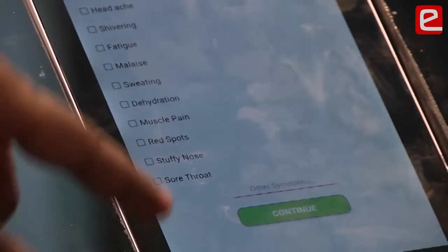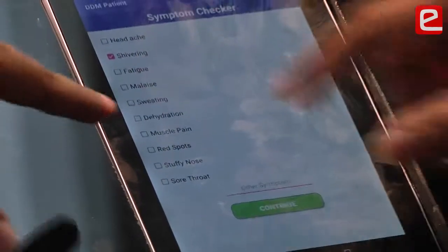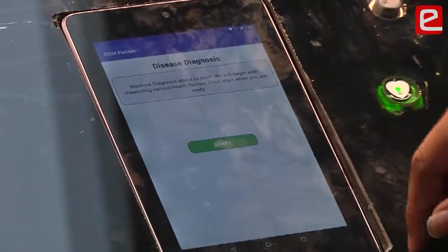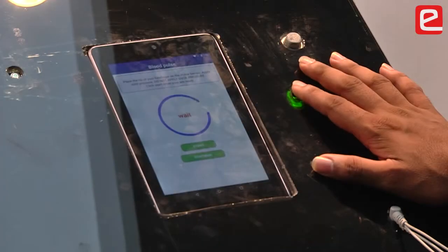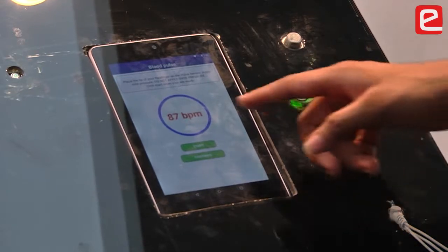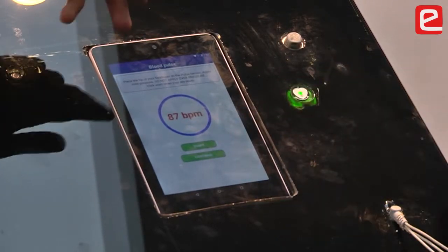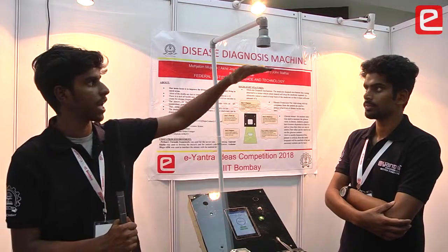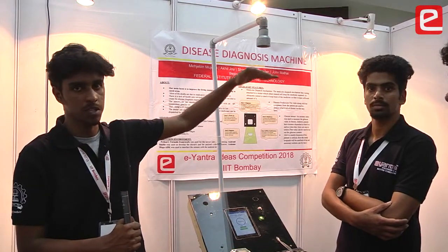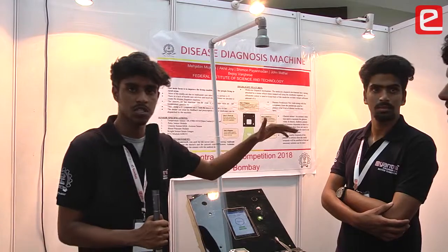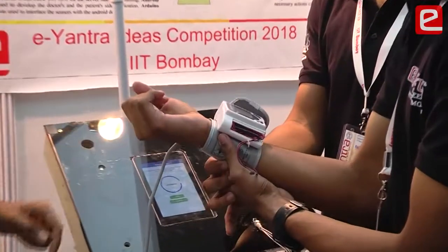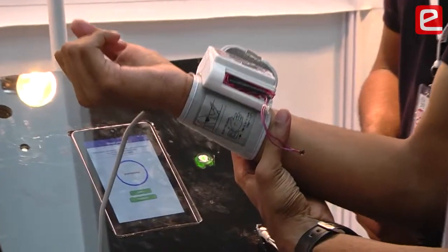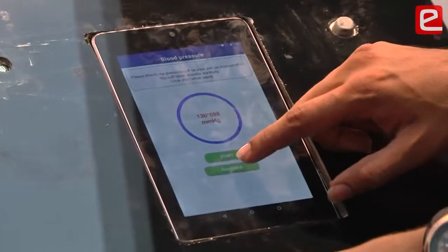We check mark the symptoms we are facing. If a symptom is not listed, you can enter it using the other symptoms option. Now let's check mark the symptoms and continue. The machine starts diagnosis — the pulse is measured at 87 BPM. We can also measure height using an ultrasonic sensor, which measures total height and subtracts the person's height from the reference. Now let's move on to blood pressure, which is measured using a blood pressure sensing module.